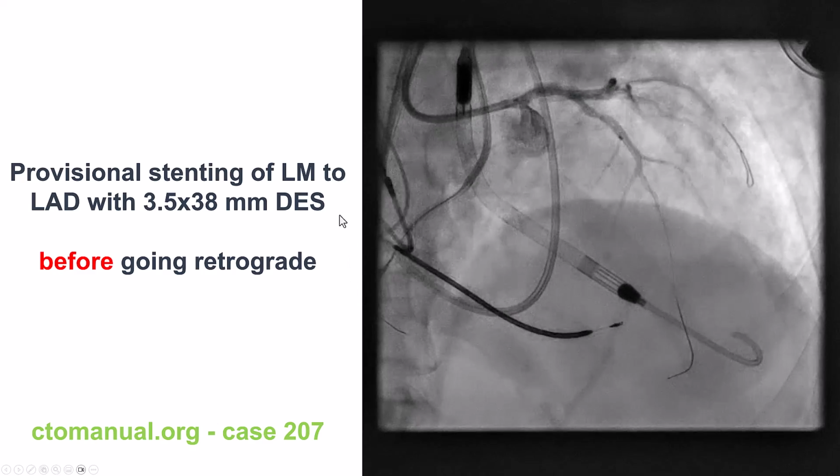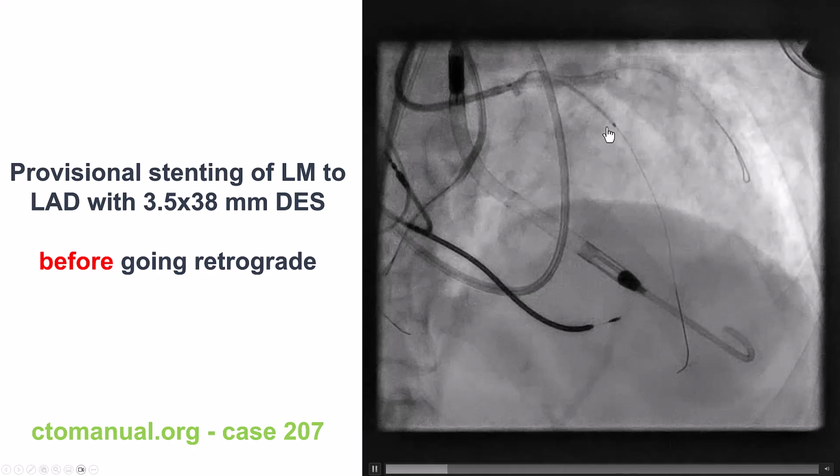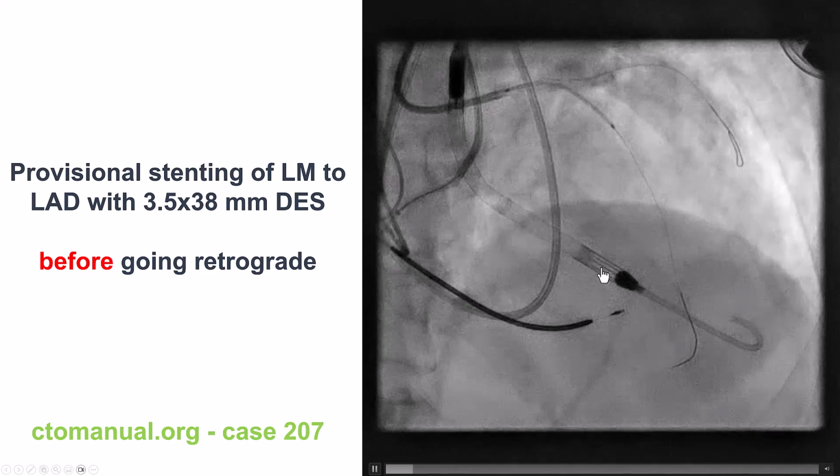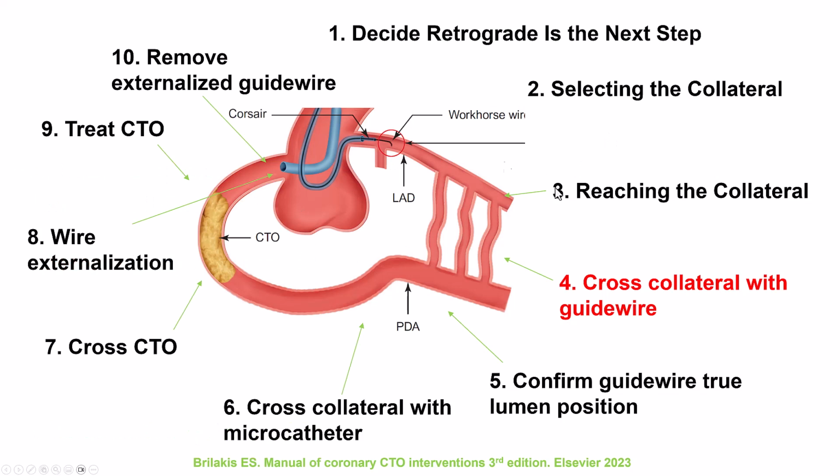This is another example in which there was significant disease proximal to the takeoff of this septal branch. So before going retrograde, we placed a stent, and then we were able to advance equipment.